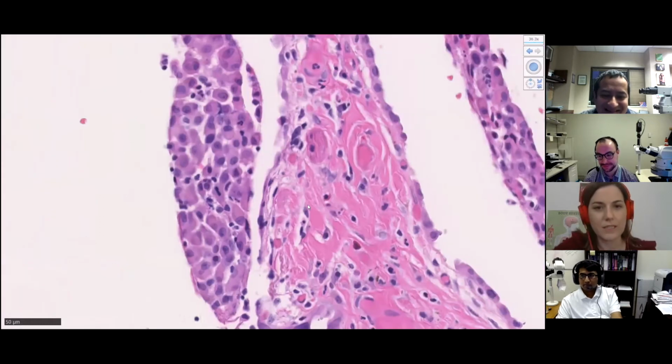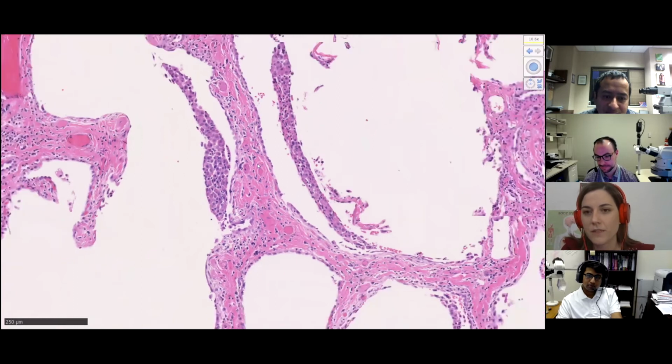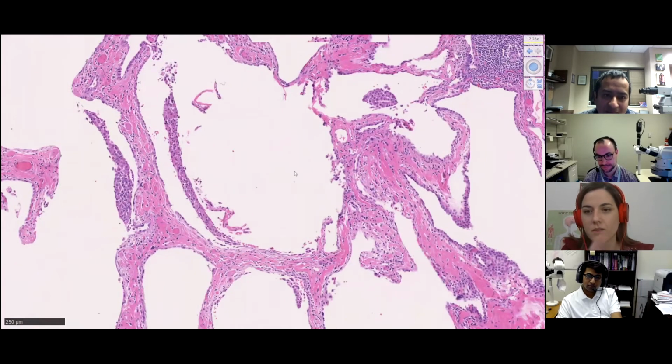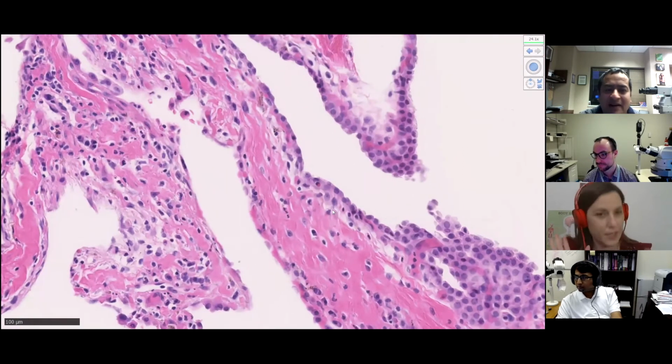I know it's diffuse, but as we have seen in the other parts, I like the collagen and the macrophages. Maybe it's this combined. But Irene, let's say this was classic NSIP, right? What would you do if it's UIP in one lobe and NSIP in another lobe?